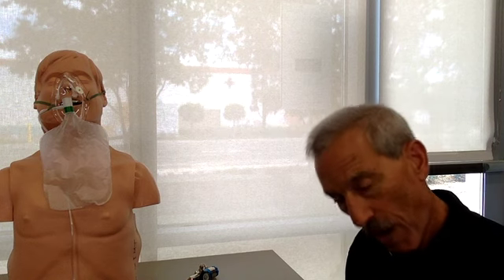So when you put a CPAP device on a patient like him, he has to breathe out against that pressure that the device is providing. So he uses more energy to breathe out than breathe in. And what can happen is he gets so fatigued, he stops breathing or he goes unconscious. So if you have a person like Bob here and you're on the way to the hospital, you've got to watch them carefully. If their head starts bobbing, or they stop talking to you, or they go unconscious, or they stop breathing, the CPAP's got to come off. They're too tired for it any longer.